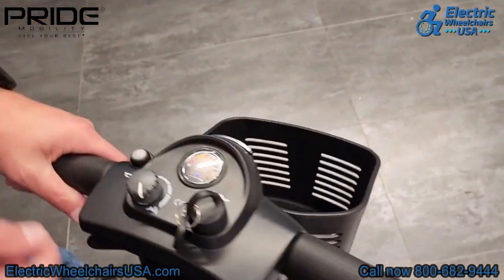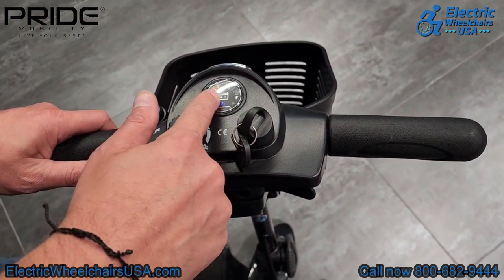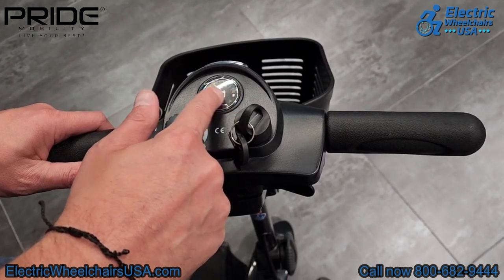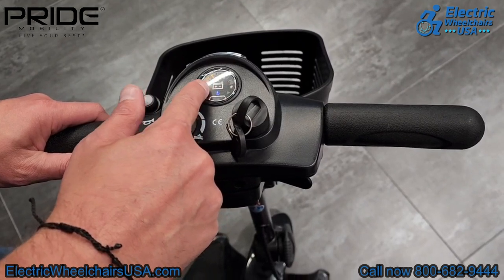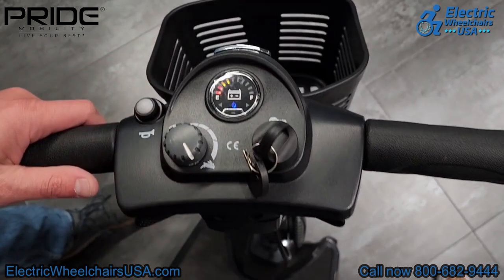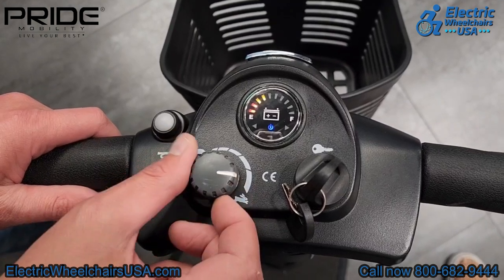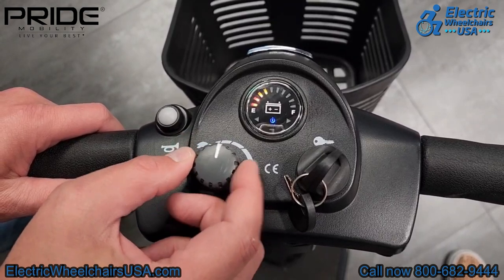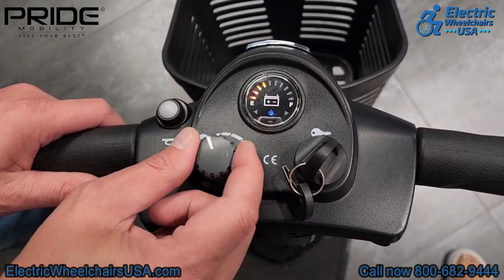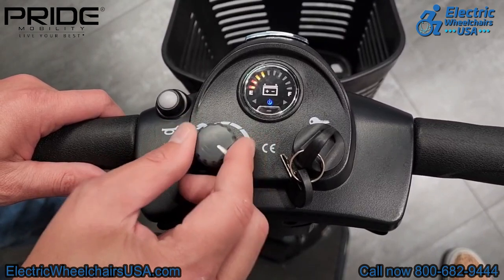On the tiller, this is the battery gauge — when fully charged all bars will be lit up. Getting in the habit of charging at around half or a quarter charge will increase the longevity and lifespan of your batteries. This is your speed control dial: turning it all the way to the right toward the rabbit gives a max speed of around four miles per hour, while turning it toward the turtle decreases speed to about half — useful when riding around crowds of people or in a store.